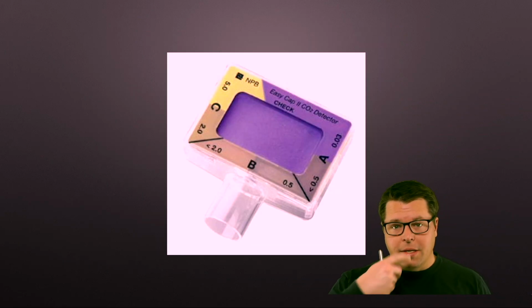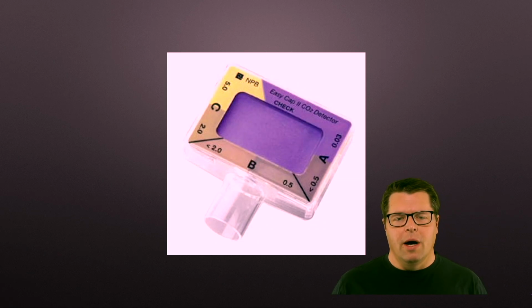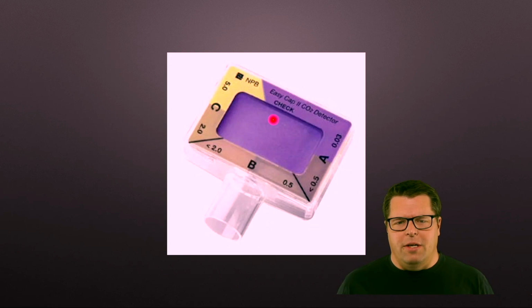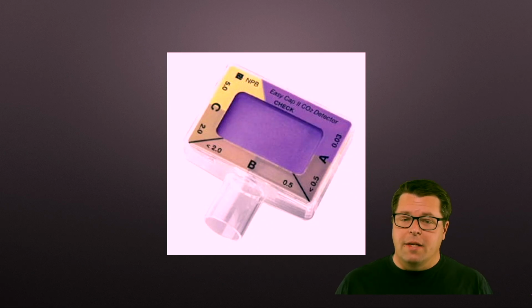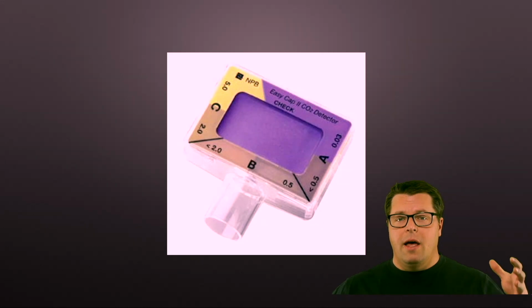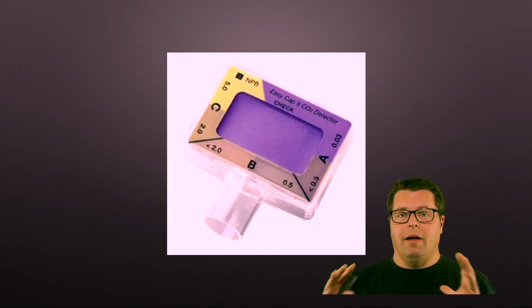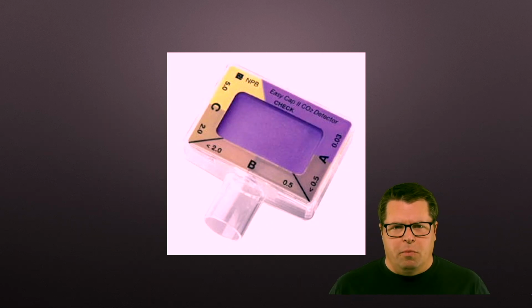Now, you may say, well, isn't this End Tidal CO2? Yes, it sort of is, or rather it's exhaled CO2, this little color changey thingy. It sort of gives you a number, kind of, but mostly just, if it turns gold, okay, cool. And that's great, except this thing can get fooled pretty frequently. It is not good enough to confirm probably one of the most important things that we have to confirm, which is that our advanced airway, the thing that we've done that will allow the person to continue to survive, is actually functional. So this guy's just not going to cut it anymore, not standard of care, 100%.